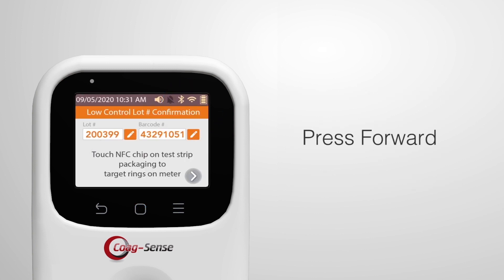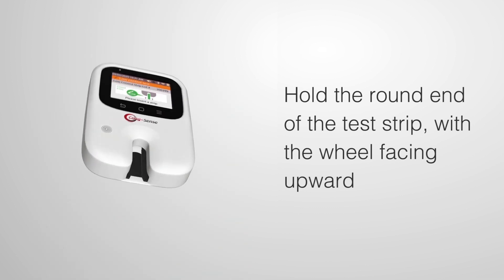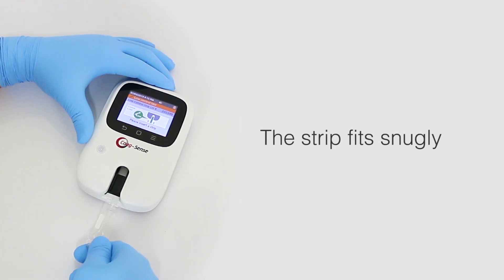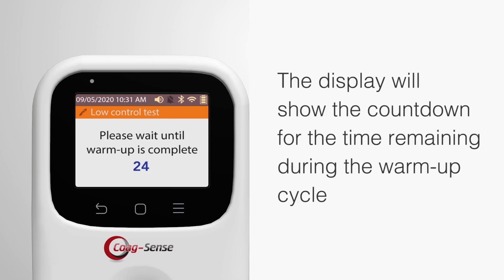Then press the forward button. Hold the round end of the test strip with the wheel facing upward, and gently insert a strip completely into the meter. The strip fits snugly and should be pushed all the way toward the back wall of the strip holder. The display will show the countdown of time remaining during the warm-up cycle.